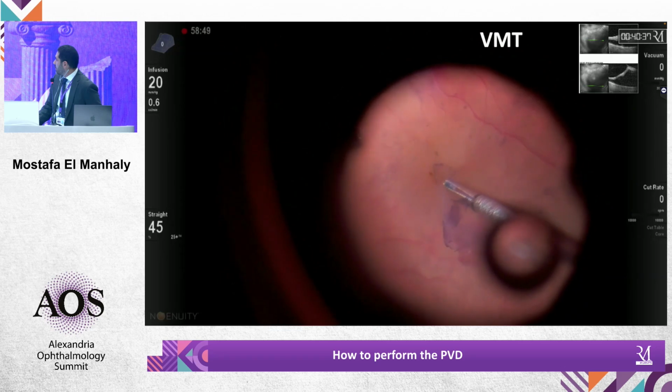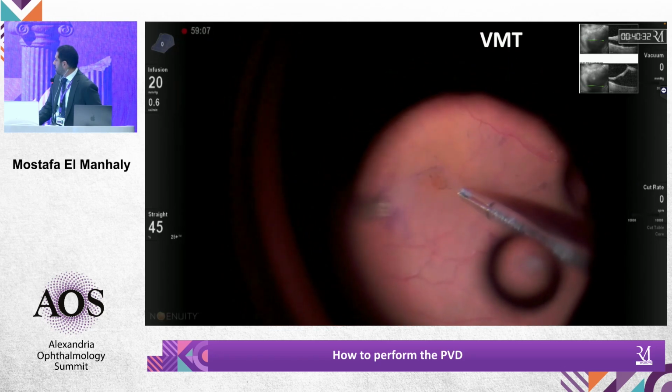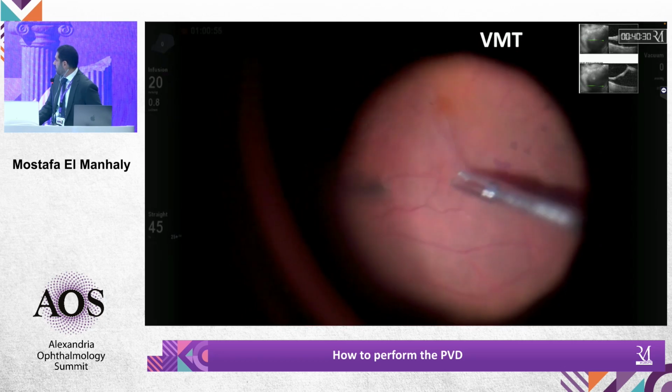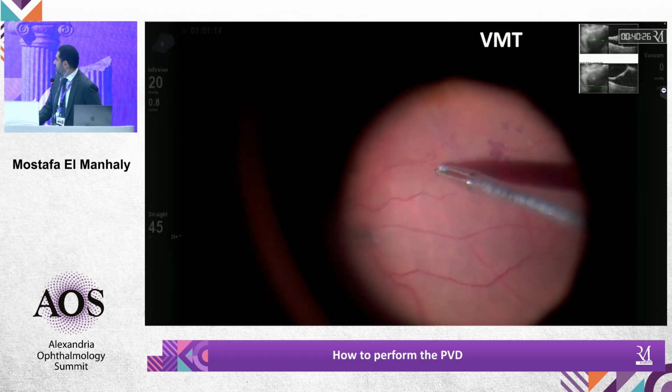If you don't find it safe to trim it early, you can do this and then go. I can just leave a little bit of a stump at the area of traction, and it won't affect anything. It's not necessarily that you remove it completely.